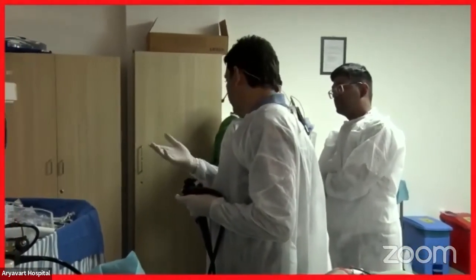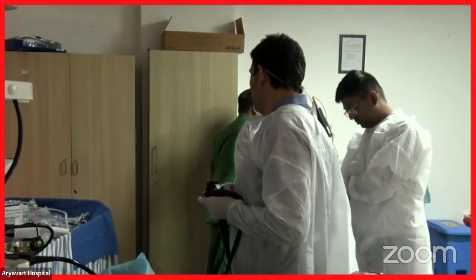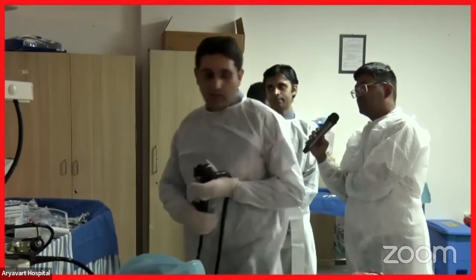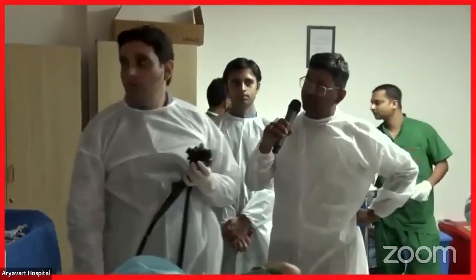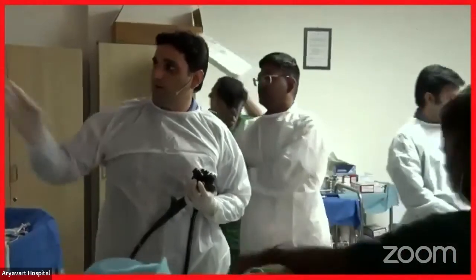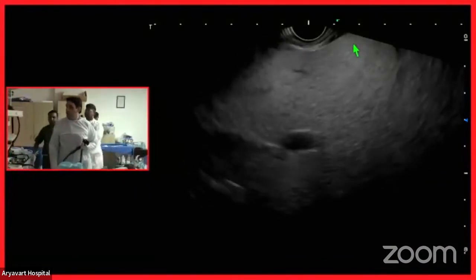Normally, if we puncture a vessel, it should bleed at that time only. If it's subcapsular, the bleed should stop on its own. But the most common cause of complication is arterial puncture. Do you apply Doppler at the track of puncture after taking the biopsy? We see that because if blood is there, the field will become blurry. The capsule area should become blurry, and we can see a new finding if there is bleeding.